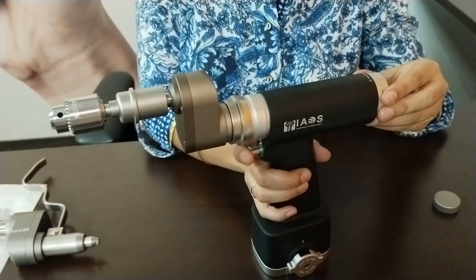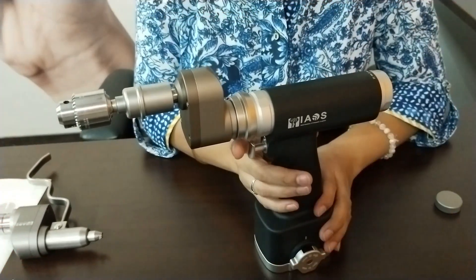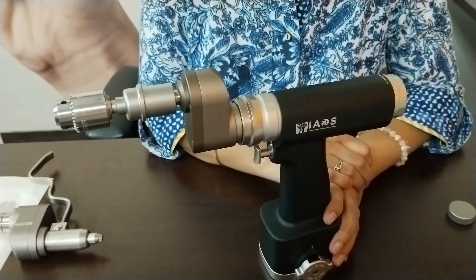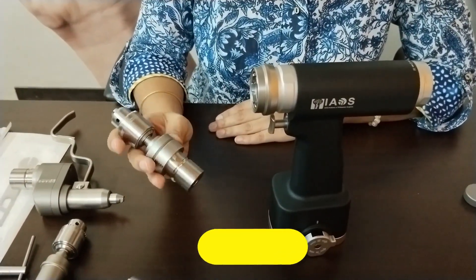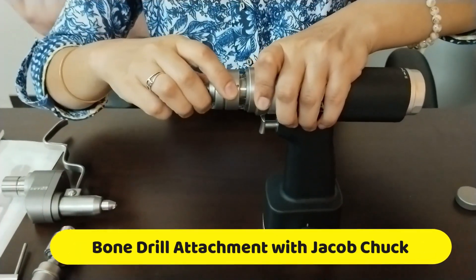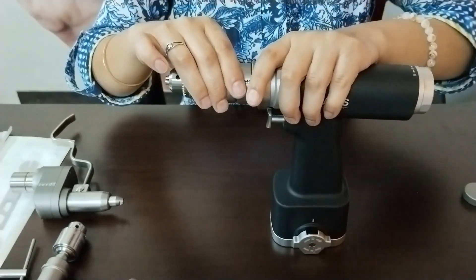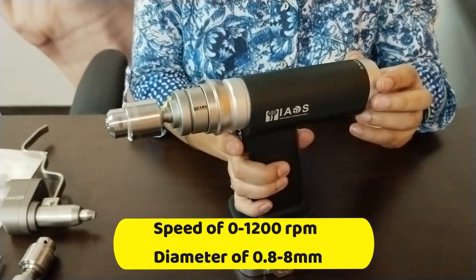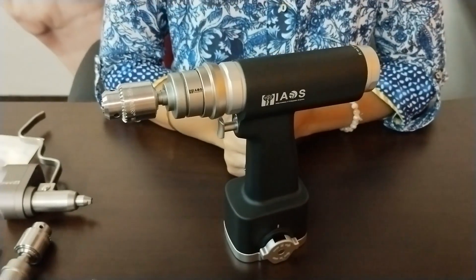This comes in two modes — forward and backward — with a diameter range of 0.8 to 8 mm and a speed of 0 to 1200 RPM. The next attachment is the bone drill with Jacob's chuck. You pull back the chuck lock and with a snap fit it's done. Its technical specifications are the same: 0 to 1200 RPM with a diameter of 0.8 to 8 mm. This is suitable for trauma surgeries.